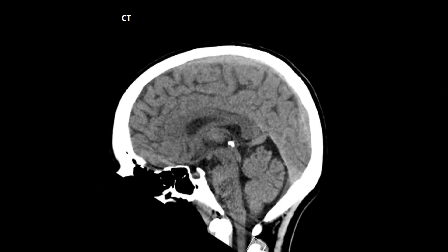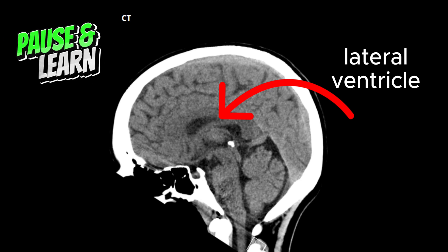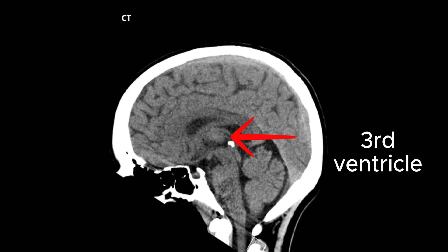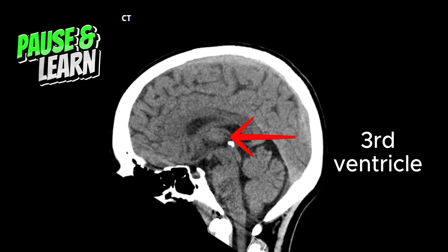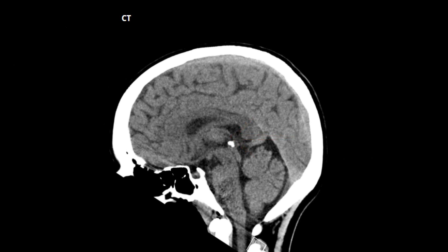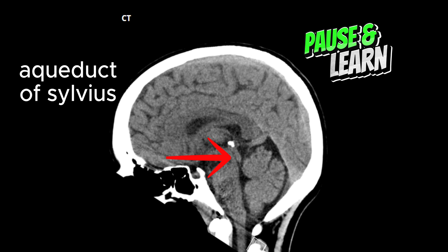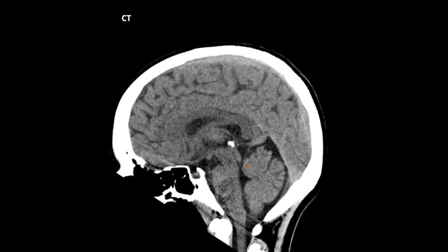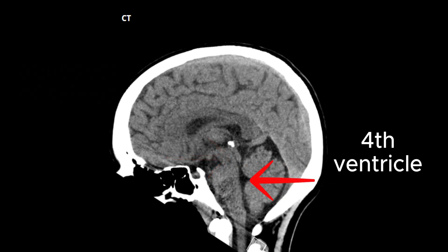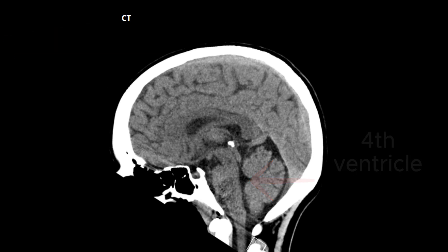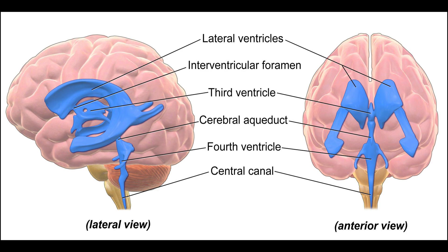Now let's have a look at the ventricular system on sagittal sections. This here is the lateral ventricle. This is the part of the third ventricle. This narrow channel here is the aqueduct of Sylvius, which acts as a communication between the third ventricle and the triangular-shaped fourth ventricle, which lies in the posterior fossa. Here is a simplified diagram.